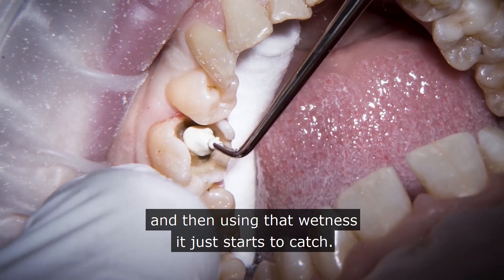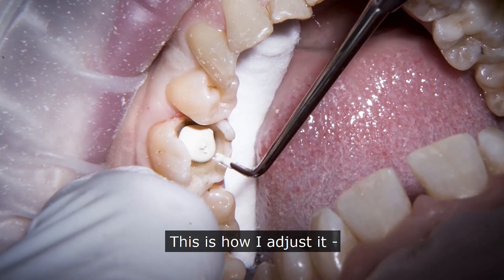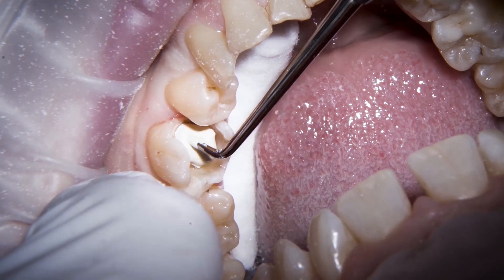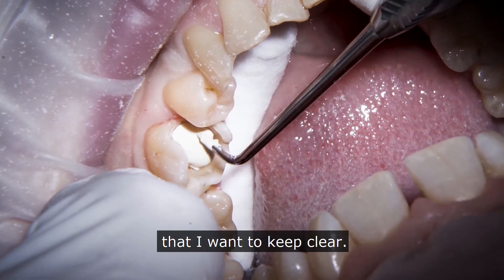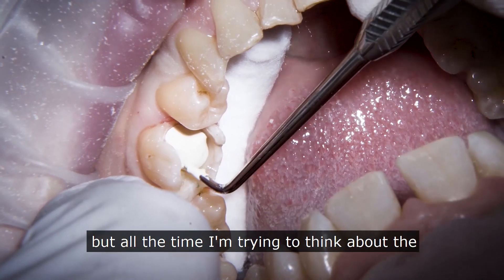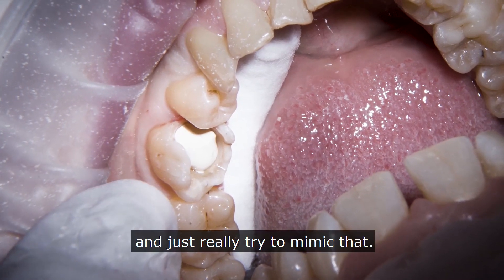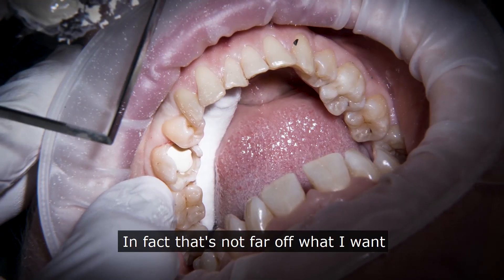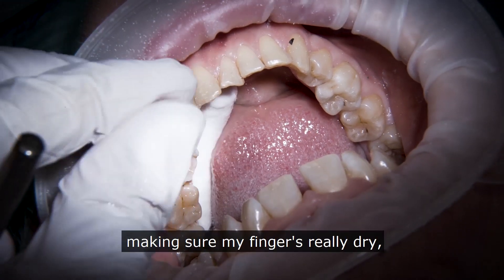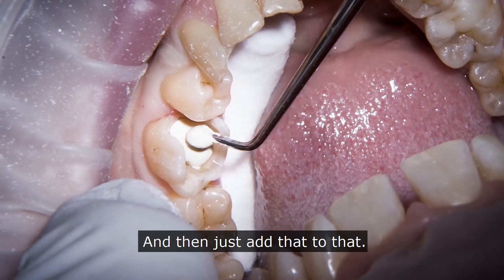That's about the size I want in here, and using that wetness it just starts to catch. This is where there's just no packing at all — you're just trying to tease this into position. I'm conscious of the margins that I want to keep clear; I can easily trim it back a little bit afterwards with a probe. But all the time I'm trying to think about the shaping of the dentine and really trying to mimic that. I'll just add another little bit — making sure my fingers are really dry; I don't want to bring any moisture in at all.